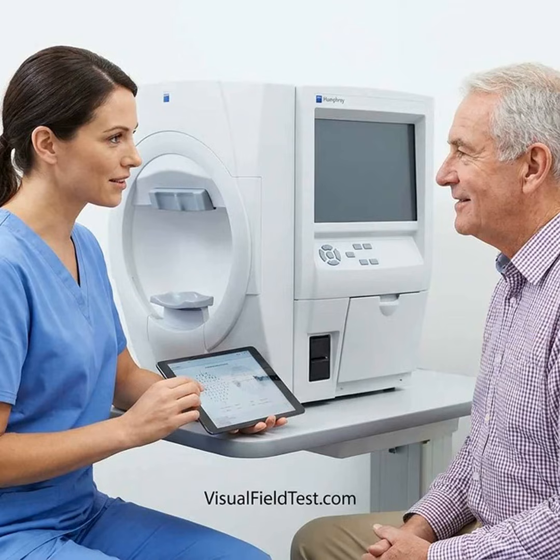Home results should not automatically be combined with Humphrey Field Analyzer results. Different devices may use different screens, stimulus patterns, eye tracking methods, algorithms, and reference databases. A recent systematic review found that tablet-based systems may have good agreement for some overall measures, but can also show measurement bias and poorer reliability indices than standard automated perimetry.